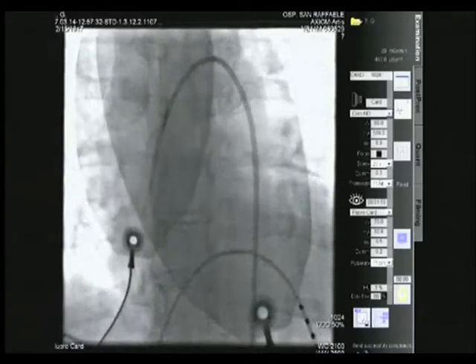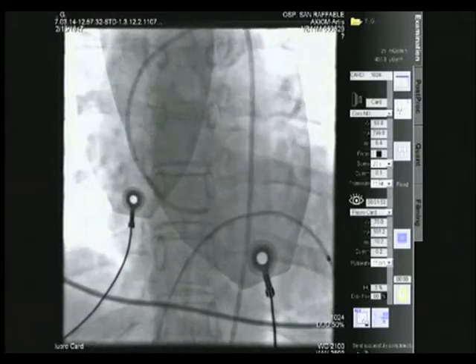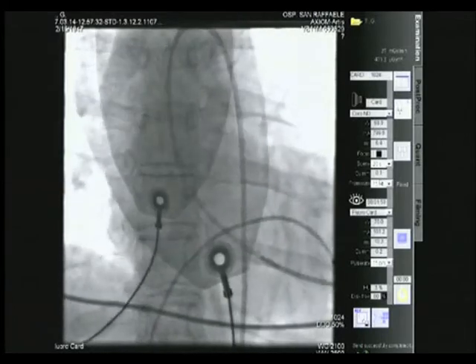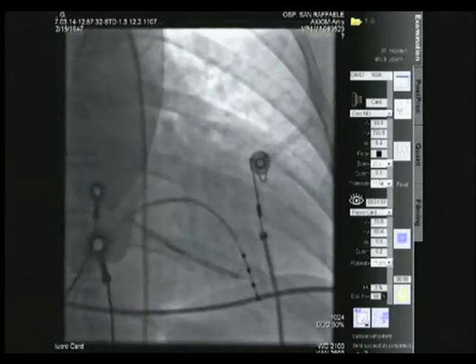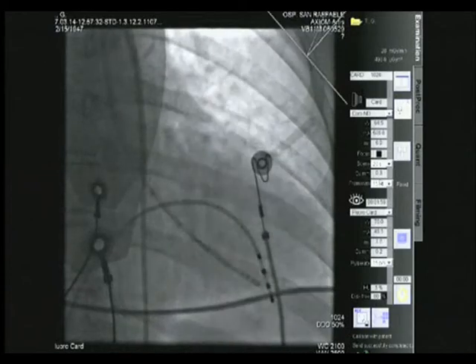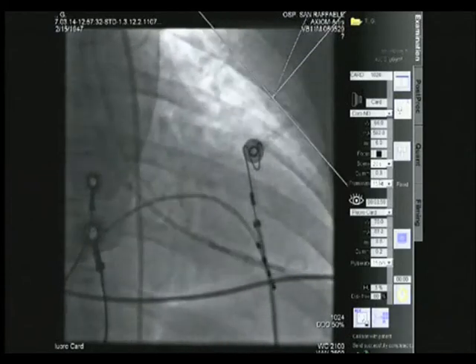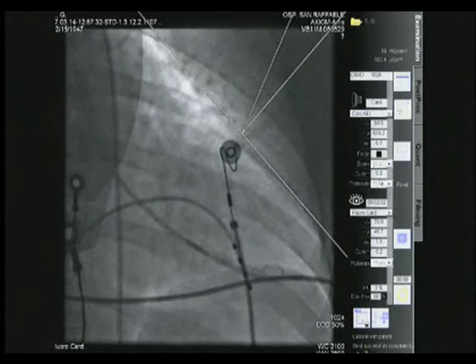We insert a combined pressure conductor catheter in the femoral artery, which is then pushed retrogradely to reach the left ventricle. When passing the aortic valve, care needs to be taken to avoid potential valvular damage by creating a U-shaped curve just above the valve.